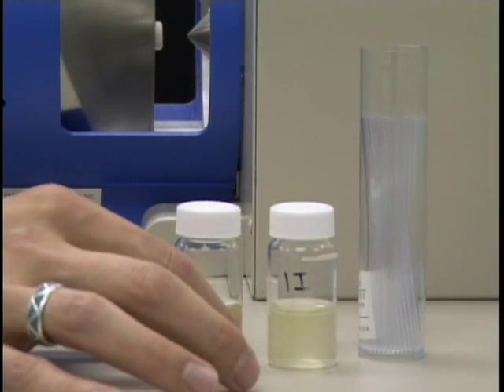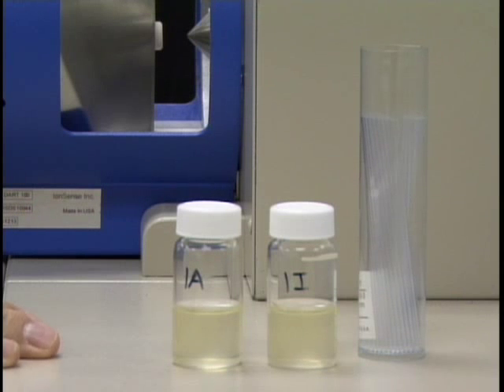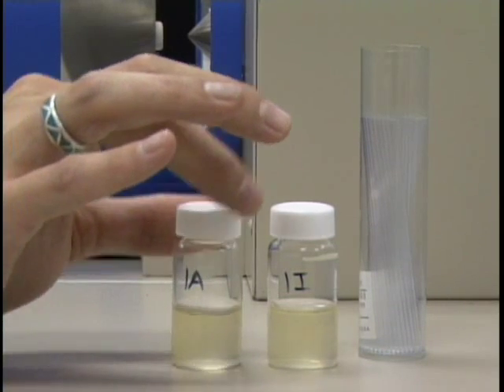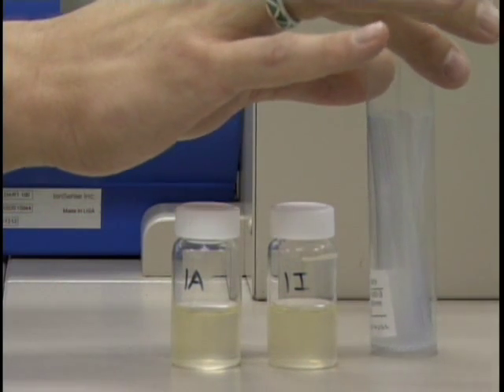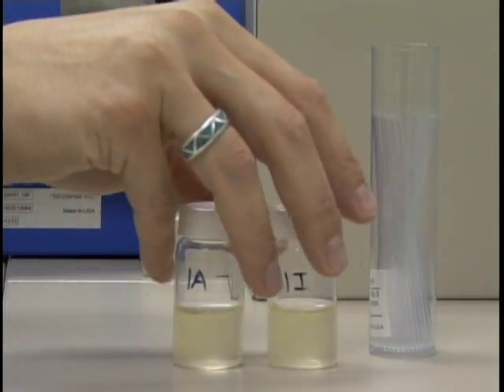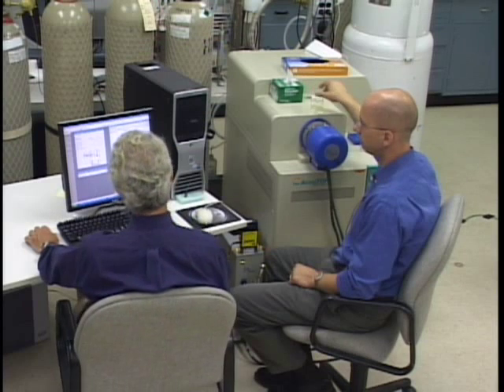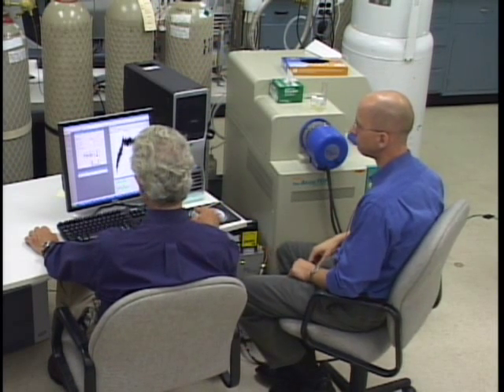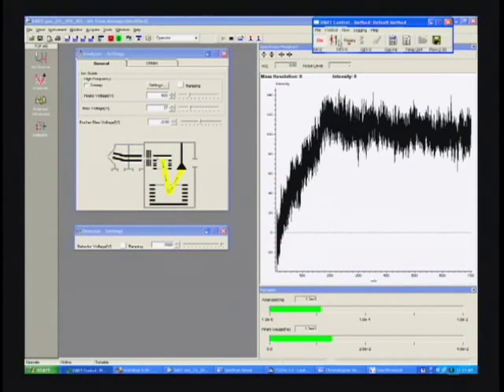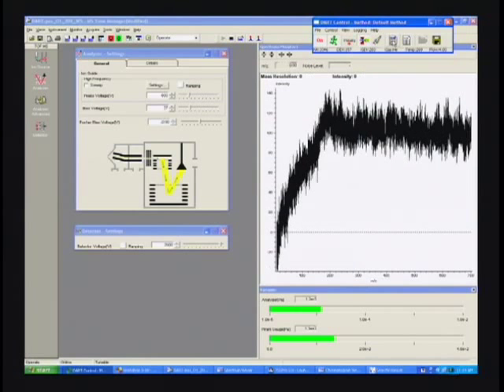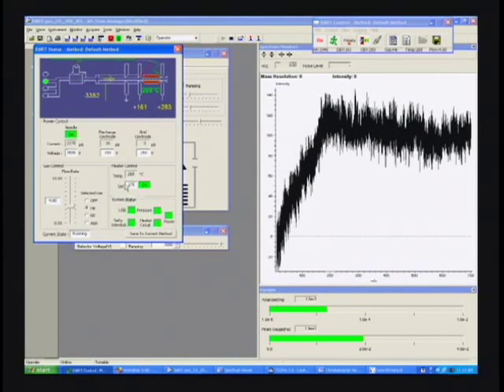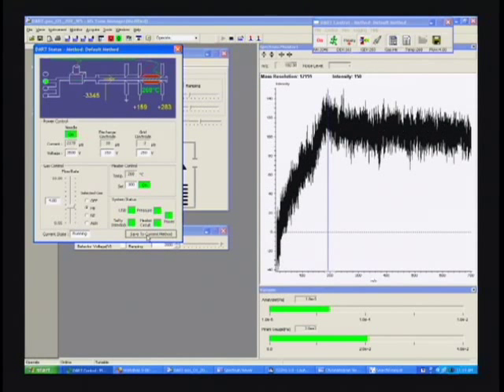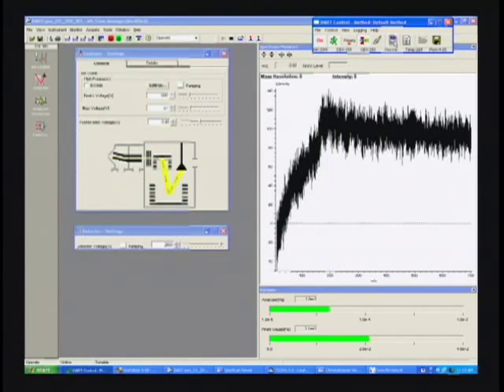With the urine samples, we've got just the straight urine that we're going to introduce. These are some urine samples that we've manufactured. We've spiked in known drugs into them, so I know what these are, but we would look at these as though they are unknown samples. We have the glass melting point tubes that we'll use to introduce these samples. We don't have anything magical about the parameters we've been using. It's just what we lit on that has worked fairly well for us.